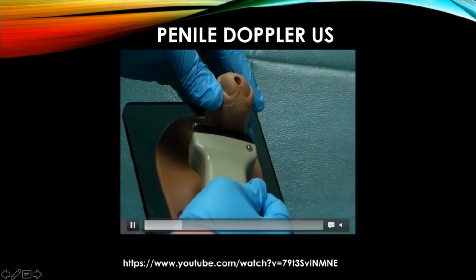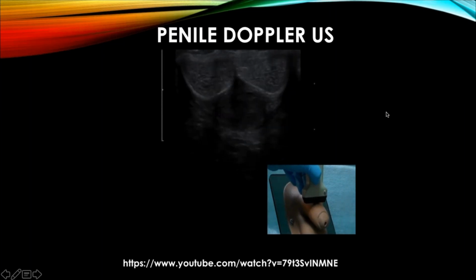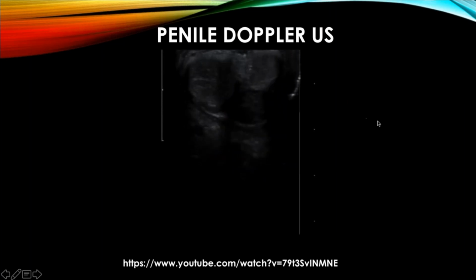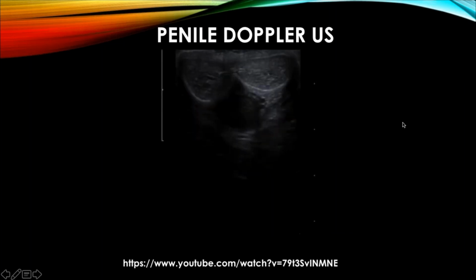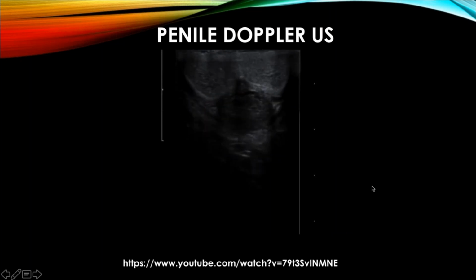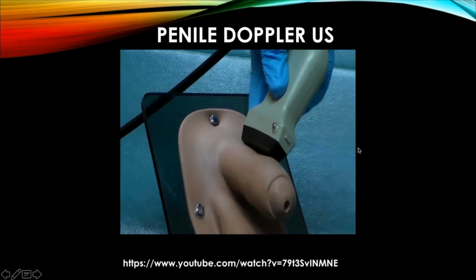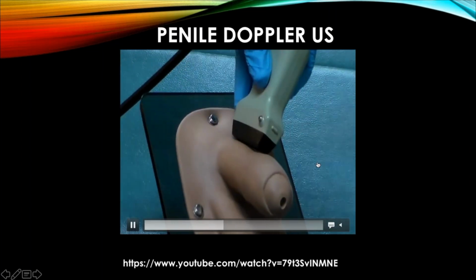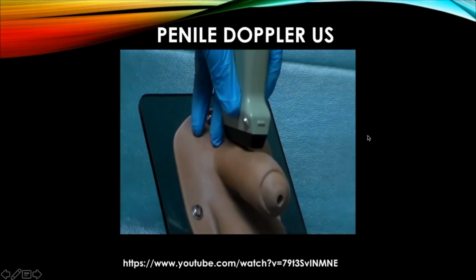If you're looking for a urethral lesion, you want to go from the bottom. If you're looking for urethral stricture disease, many times people will inject gel into the urethra to fill the lumen to see if you can see strictures. So there's a lot of added things you can do depending on what type of test you're looking for. But for classic penile duplex Doppler ultrasound, you're mainly looking for arteries, and you want your angle somewhere around 60 degrees.